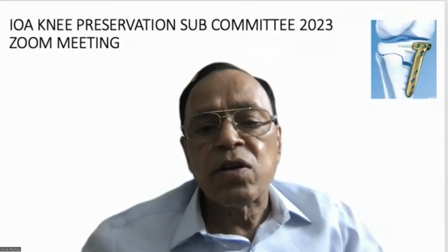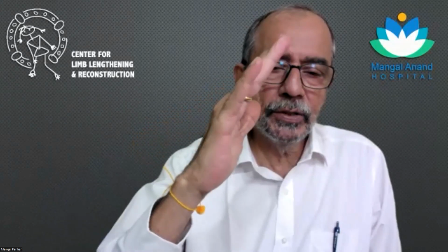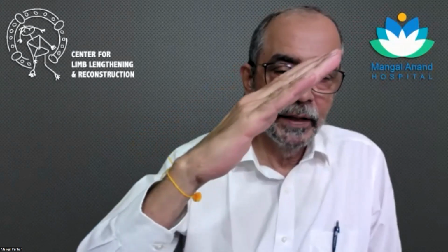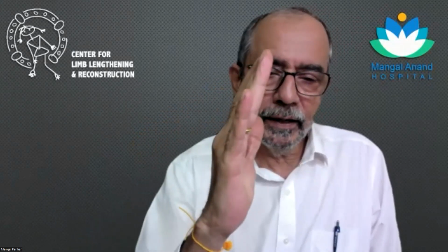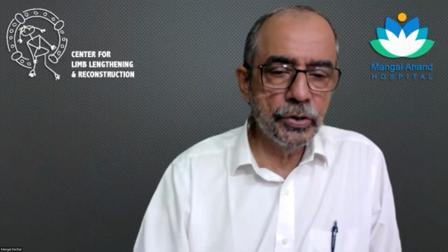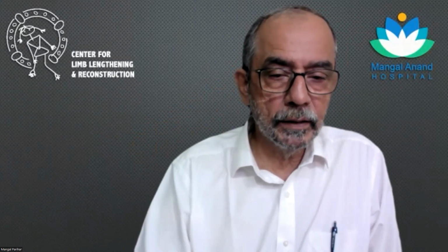Okay. So the curvature of the tibia allows the screws to be placed to go more in the lateral direction than in the posterior. Yes. But then the same thing happens which you are talking of, that the plate, instead of sitting along flush, tends, because the anteromedial tibia is kind of angled, to sit a little proud. But that is one of the recognized issues with the Tomofix, a prominent plate which requires removal.